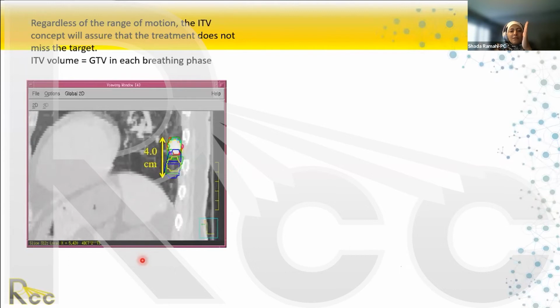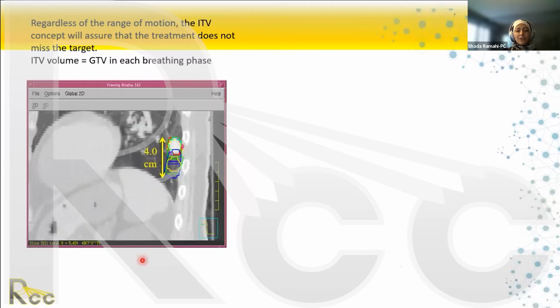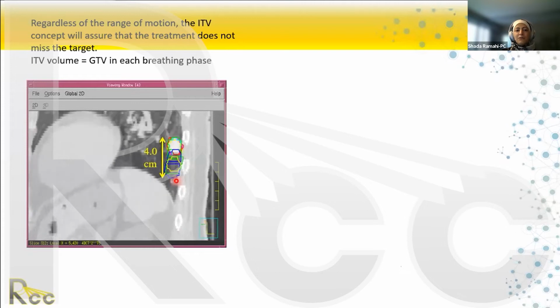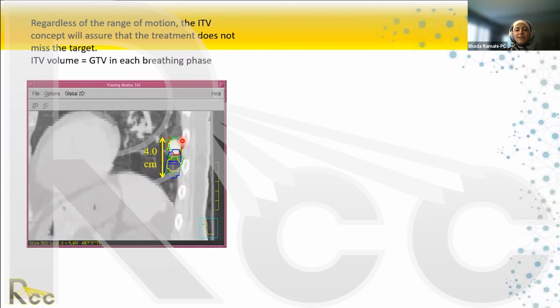The degrees are the phases. So 90 degree, phases are different locations on a circle. In terms of motion management, phase 0 is this bottom part here, when the tumor is at maximum inspiration. Phase 50% is when the tumor is up here at maximum exhalation.